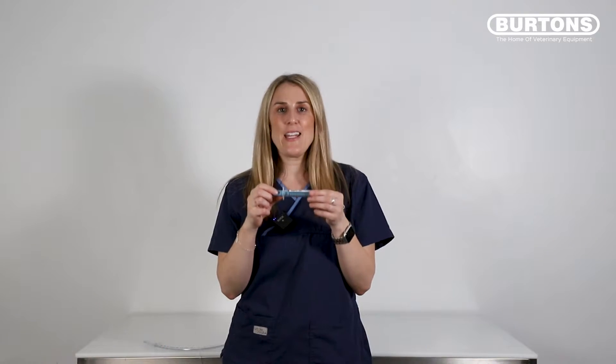Hi everyone, I'm Courtney and in today's video I'm going to show you how to use the AG Cuff Fill. It is both a cuff inflator and manometer.